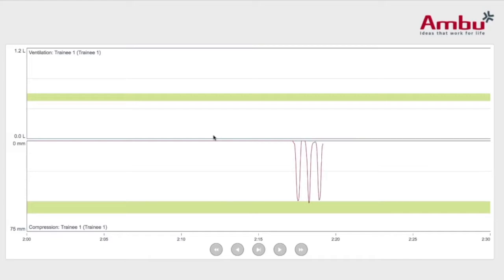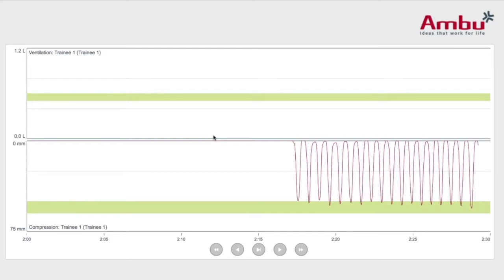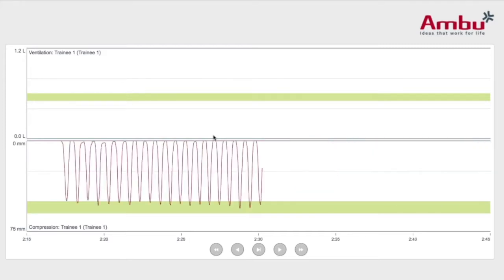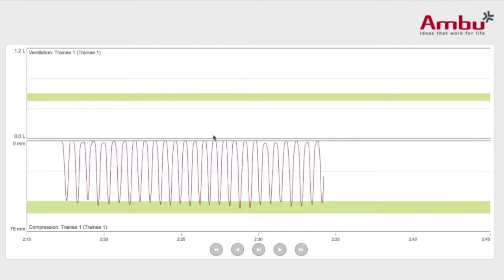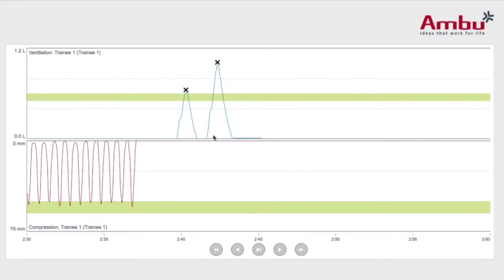Here's our compressions, and then our ventilations. The X is at the top of the ventilation, showing that we over-ventilated. The ideal spot is the green line.